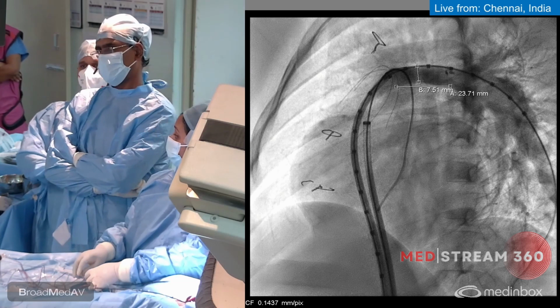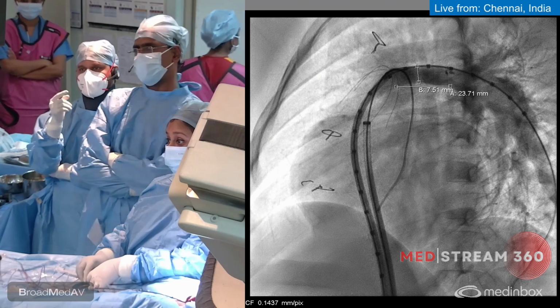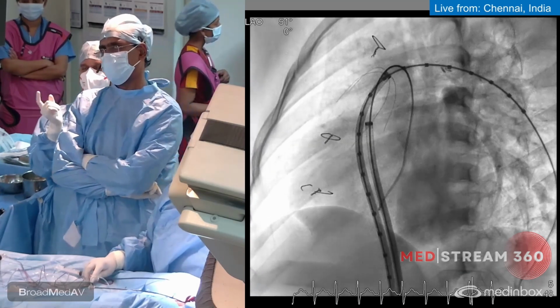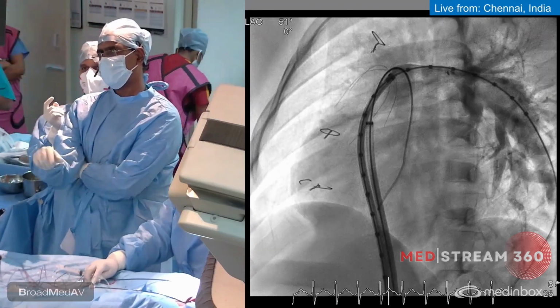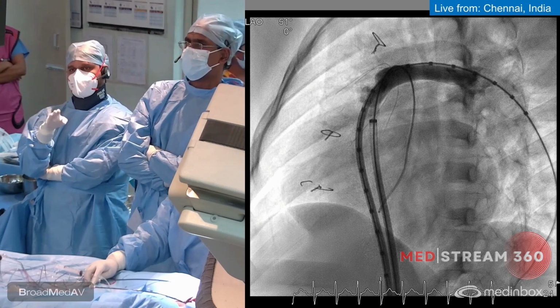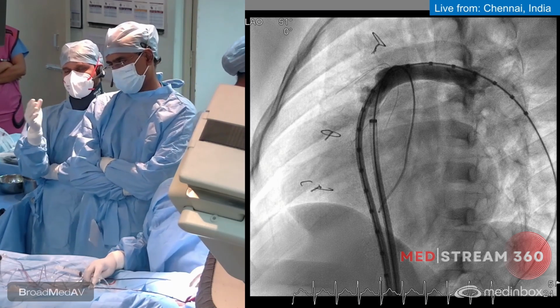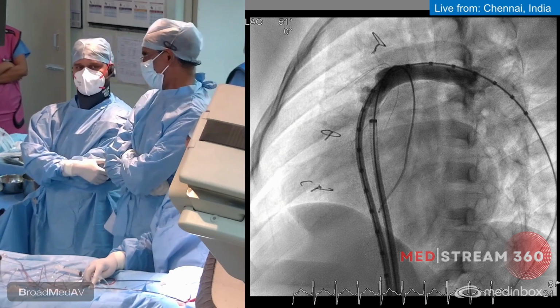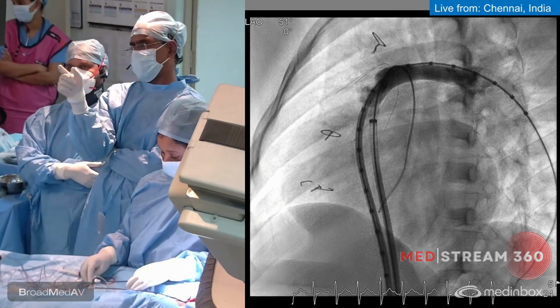I'm thinking about it. The length is probably again wrong here. Can you show the angiogram again? Can you freeze the image and show? Go back a couple of frames. Correct. Next frame. Correct. So here, if you see, again 4 markers. It's almost 3.5, more than 3.5 markers. So I'm considering, shall we consider a 10 by 4 here? 10 by 4 should be fine.